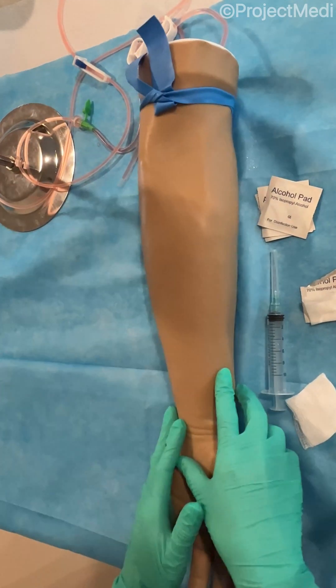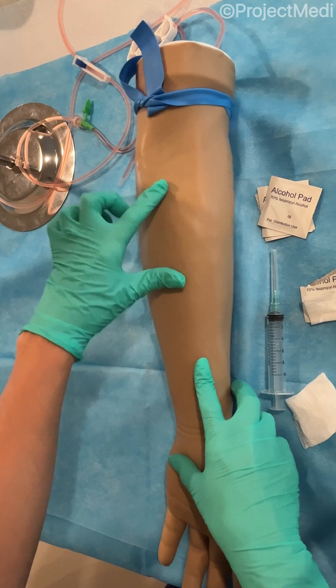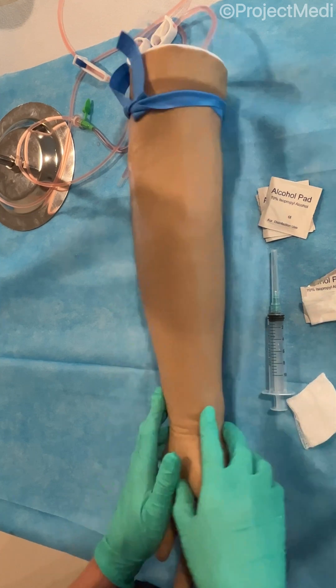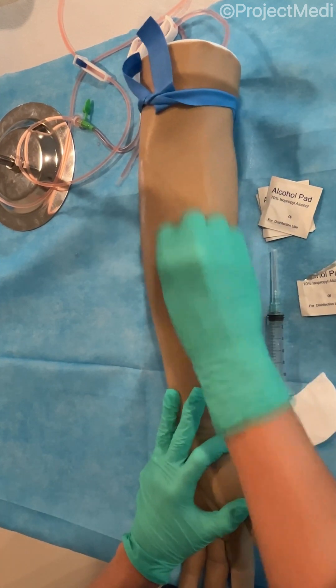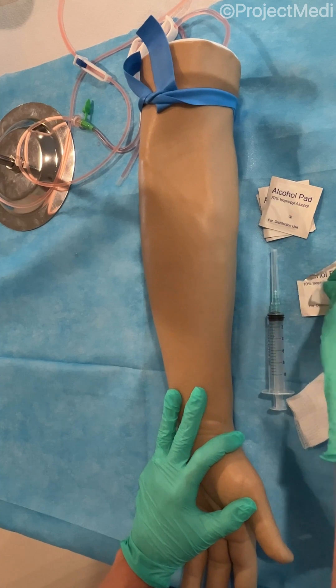After you've applied the tourniquet, you can begin to palpate the arm and feel for veins. Take note that this vein is more on an angle in the antecubital area, so you're going to follow along the angle when inserting the needle. Next, we're going to clean the arm using an alcohol swab to disinfect in an up and down and side to side motion for at least 30 seconds to ensure the skin is disinfected.